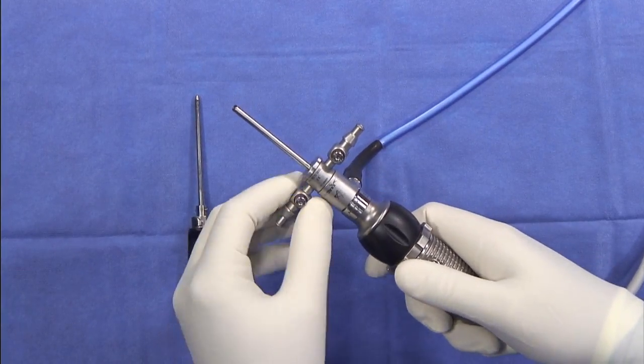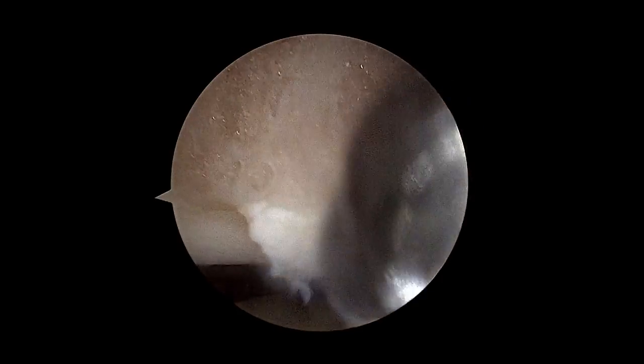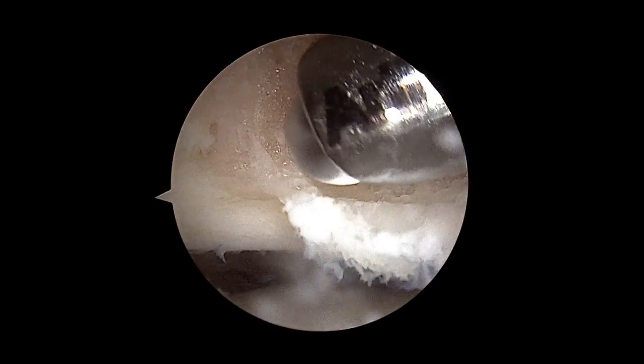I have found that the Arthrex HD4 camera head has been an excellent addition to my surgical procedures. The image quality for the HD camera is extremely high. The fine detail allows me to see pathology and tissues that I wasn't able to see in the past.